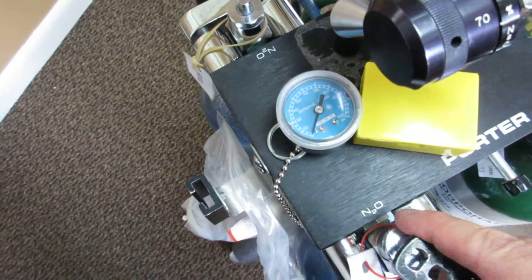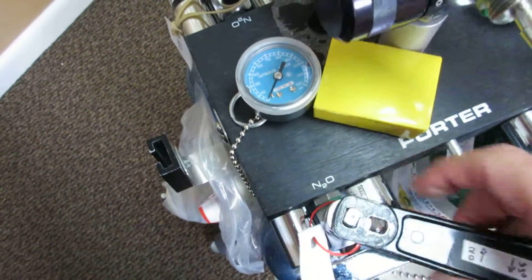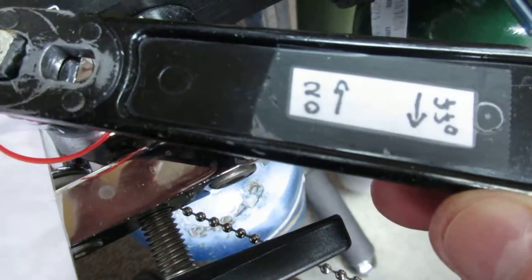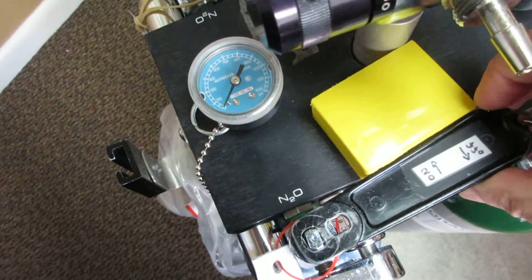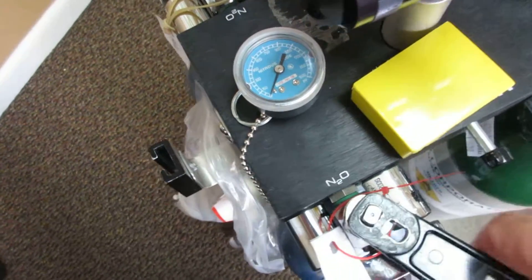I already checked that manually. So now we can take this tank over here, turn it on. Righty-tighty, lefty-loosey. And notice I even made a little diagram. Push it around, gauge does not move. That tank is empty.